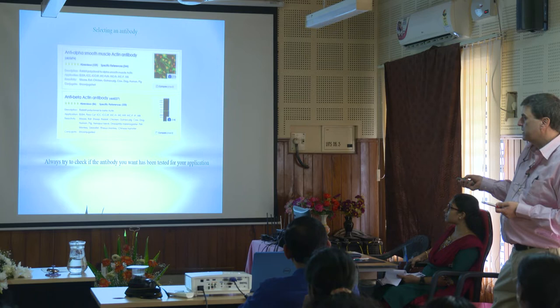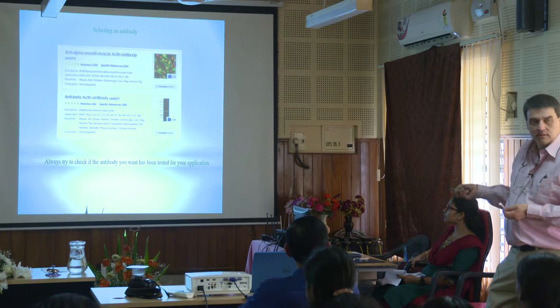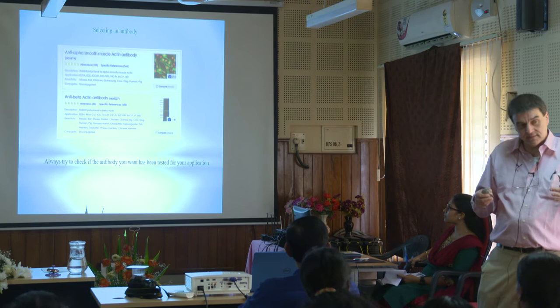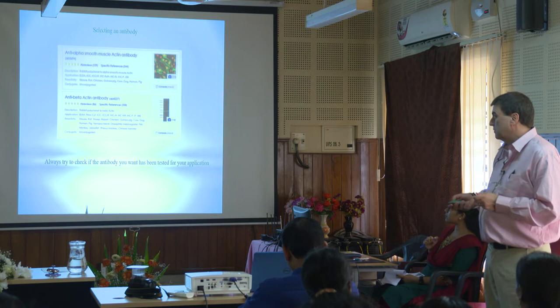It also works for immunocytochemistry and immunofluorescence. The reason they put these in here is that not all antibodies will work for all applications. So don't buy something for immunofluorescence when the only thing it says is ELISA or Western blot. Chances are it might not work for immunofluorescence. The companies don't do every test, but they usually have proof that a particular antibody works for that particular application. So keep that in mind when you buy them.